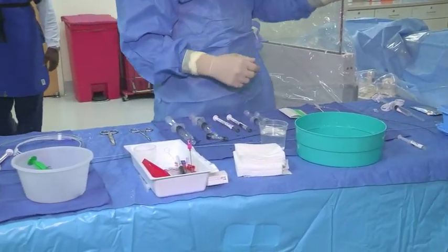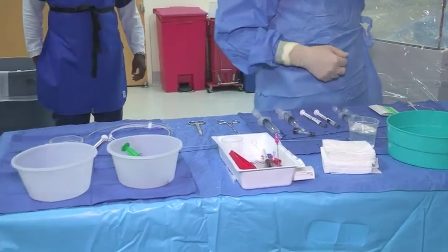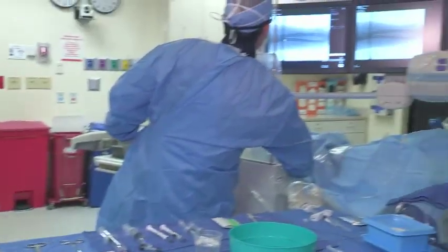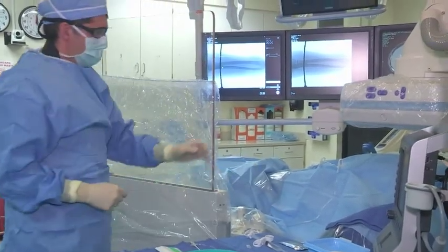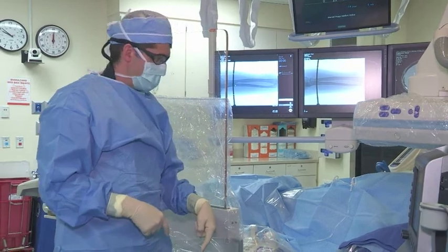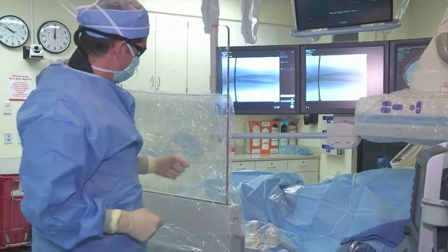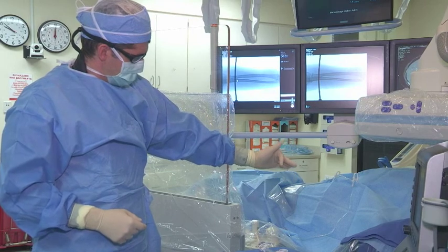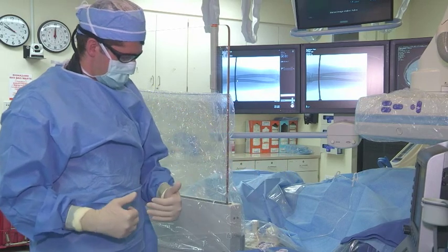Before we get started, I always like to have the patient's arm already in the screen. As you can see there, we have the patient's arm positioned, x-ray pedal next to my foot, ultrasound is ready, and we have the shield between the source of radiation and us.